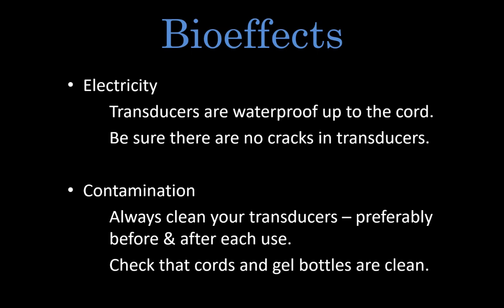And a couple of last comments on bioeffects. Remember that transducers are waterproof up to the cord and thus can be used with gel and with a process known as water baths. However, any significant cracks in a transducer housing or submerging them below the cord can potentially cause a shock hazard. And always clean your transducers with the appropriate wipes, preferably before and certainly after each use. Check your cords and gel bottles and the machine keyboard, etc., which are often overlooked as these will sometimes end up with body fluids on them as well.